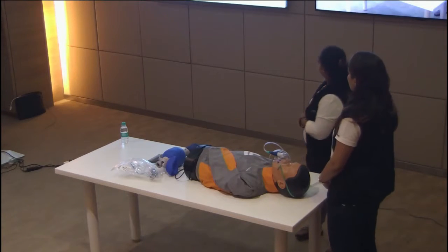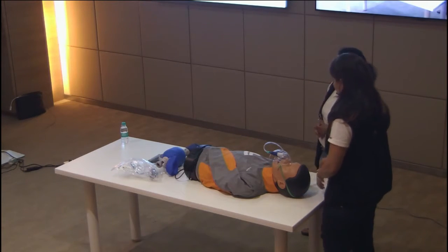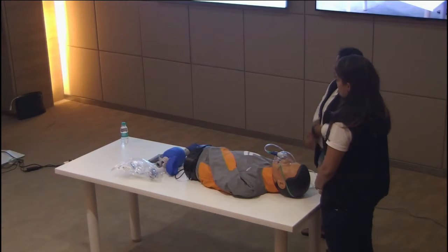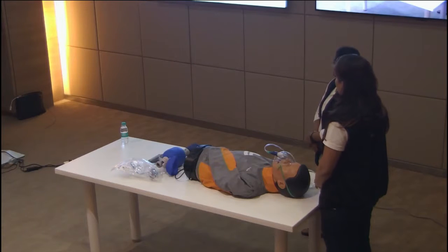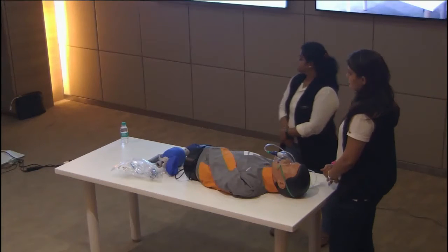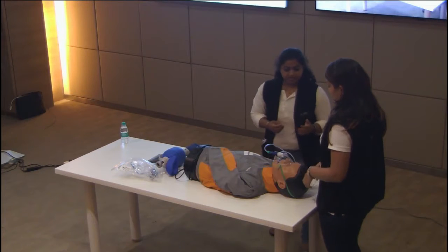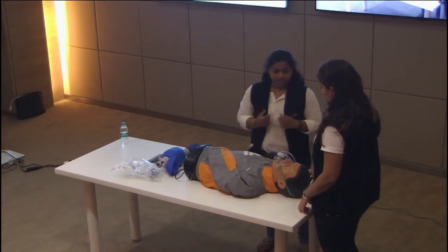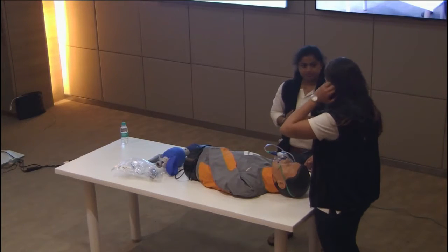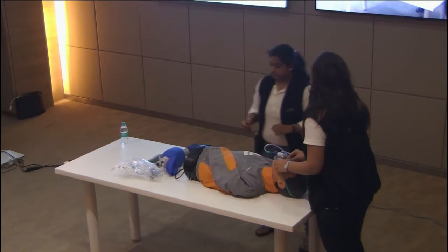All right, so both the doctors have been trying their level best to get that oxygen up, and they've applied a face mask, but the saturation is still around 88 and has not really gone up, and the patient's respiratory rate is 38. Now, they've lost 4 good minutes trying to improve this patient, and doctor, what are you doing? Can you do something further? I don't think he's doing too good, and we are losing our 4 precious minutes. I think so. We can try the NRBM. Let's get the NRBM and just try it and see if it helps. But yeah, we'll see.